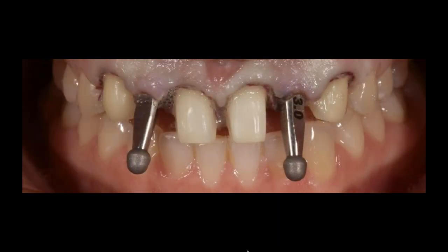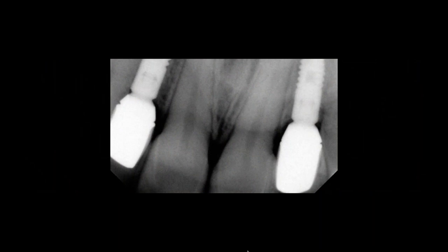So in the end, we did wind up moving our teeth around, prepping them very aggressively, which we also wouldn't do today, and placing 2 3.0 implants, which back in those days were brand new to the market and didn't really have the option to restore unless you restore them from the company. So you can see the abutments were placed that were made by the company with 2 cylinders over them that barely fit on them. They were just temporary cylinders. And I can tell you that looking at this x-ray from 10 years ago, it kind of sends a chill down my spine. I don't know how you guys see this, but you'll see why in a second.